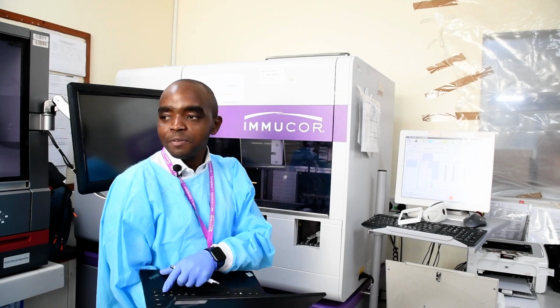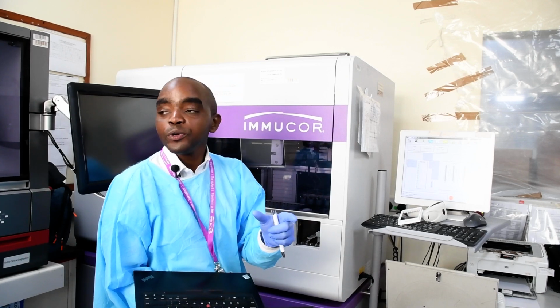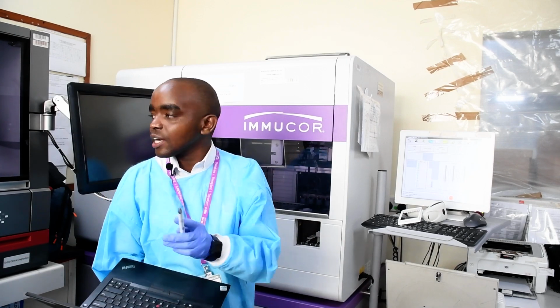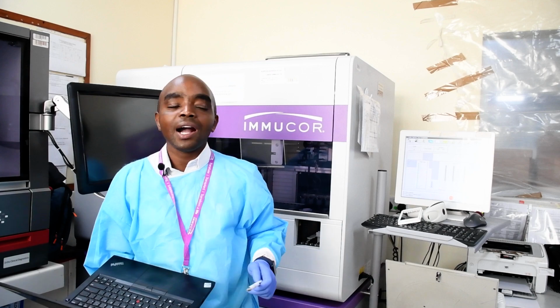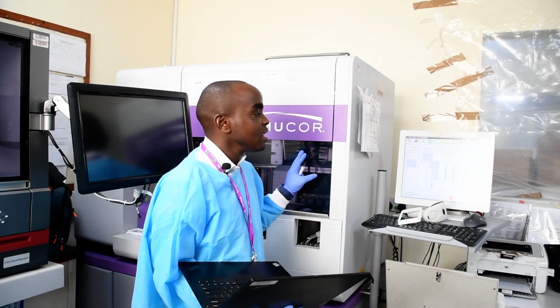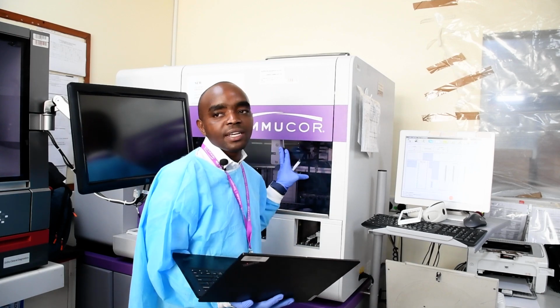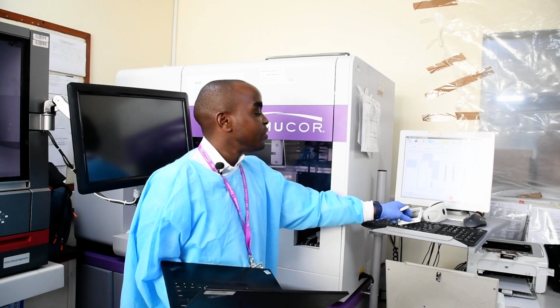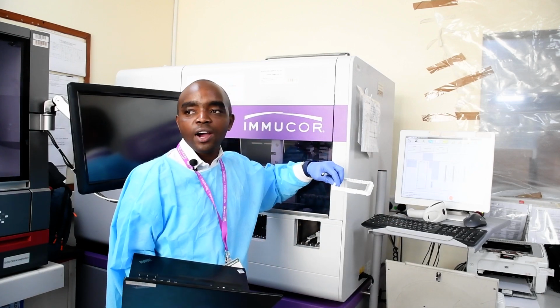Of course you have different methods. You have the tube technique, that is the manual method, and we know that there are also automated systems that use tube technique. We have the column agglutination technology like this one, or our gel. And you also have what we are concentrating on today, which is the solid phase red cell adherence, or the capture, the one that uses this kind of plates on our Neo Iris.